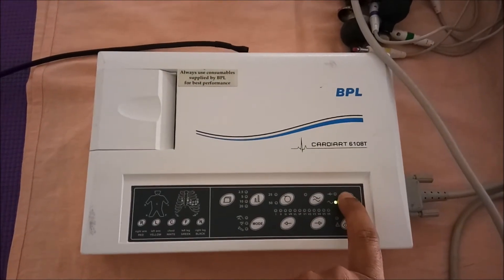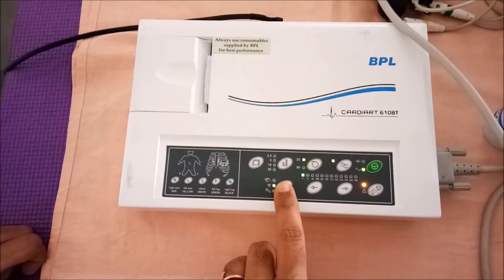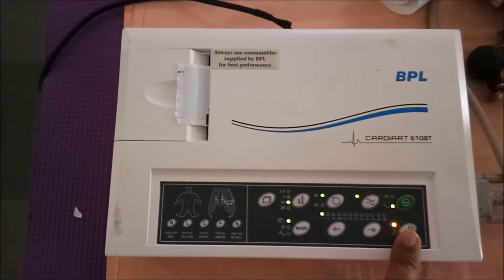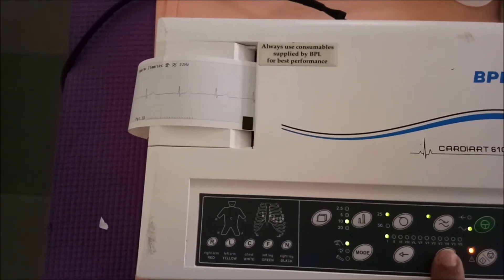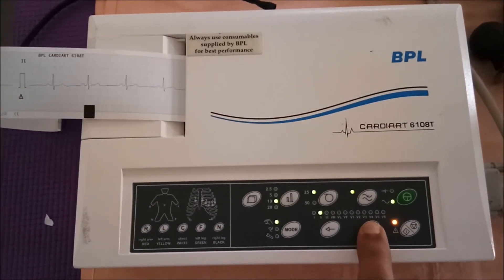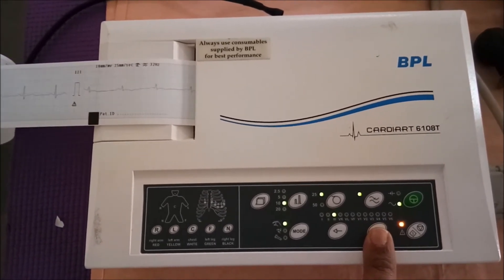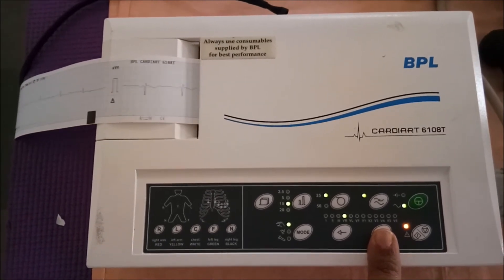Before starting recording the readings, turn on the machine with a long press of the green button. Then change the mode to manual mode. Once done, choose the particular lead required. Now I am choosing Lead 1, now Lead 2, next Lead 3, followed by AVR, AVL, and AVF.